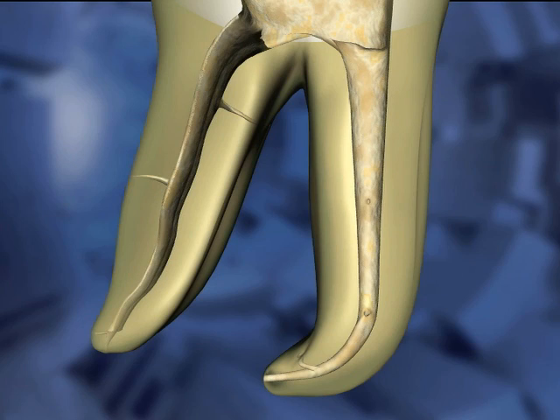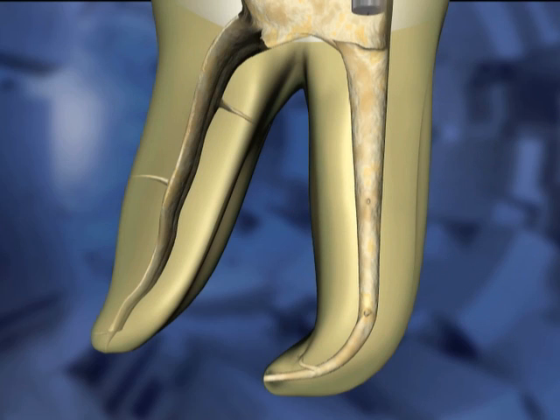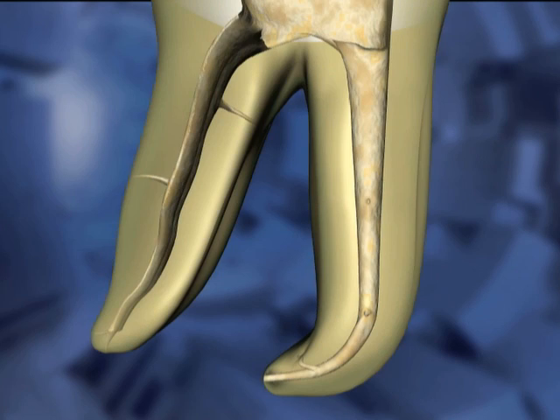Pluggers are fitted into the canal space in succession. In this animated example, the large plugger reaches a few millimeters into the canal space. A smaller plugger goes several millimeters further, to mid-route in this example. The smallest plugger should get within 5 millimeters of the working length.